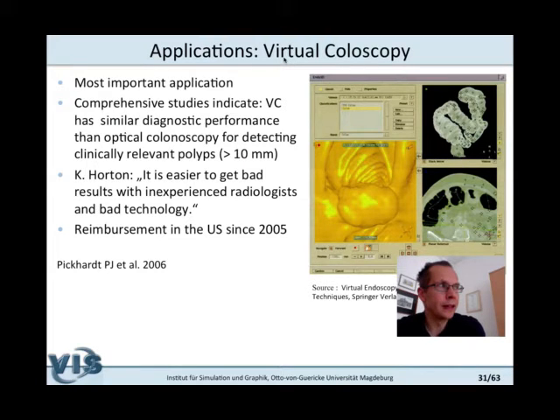We discussed last week the approaches to virtual endoscopy: segmentation, skeletonization, path planning. We also discussed why this is useful, what it can be used for, and some applications without a lot of detail.